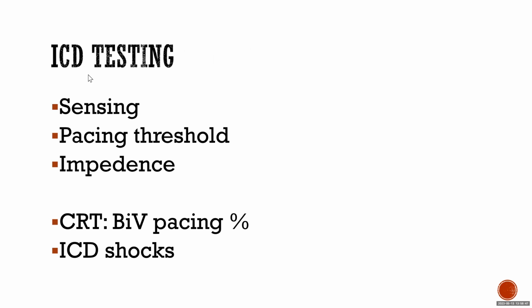Because we said ICDs can pace and can do defibrillation, all that we talked about with the pacing testing will apply to ICD, right? Sensing, pacing threshold, and impedance.